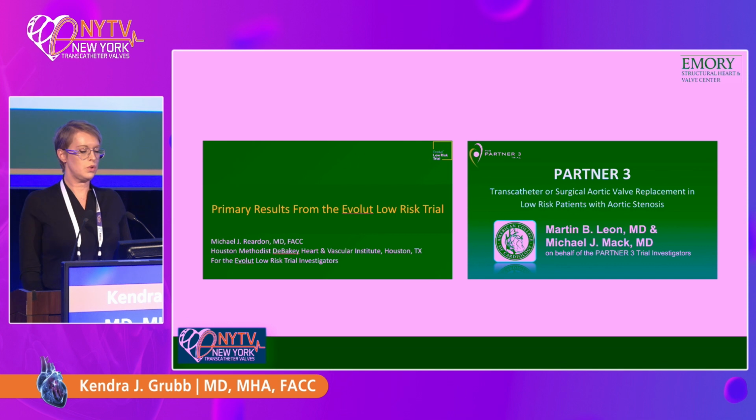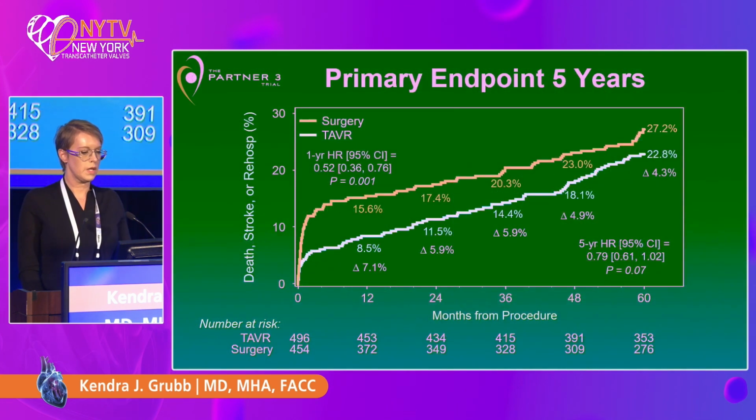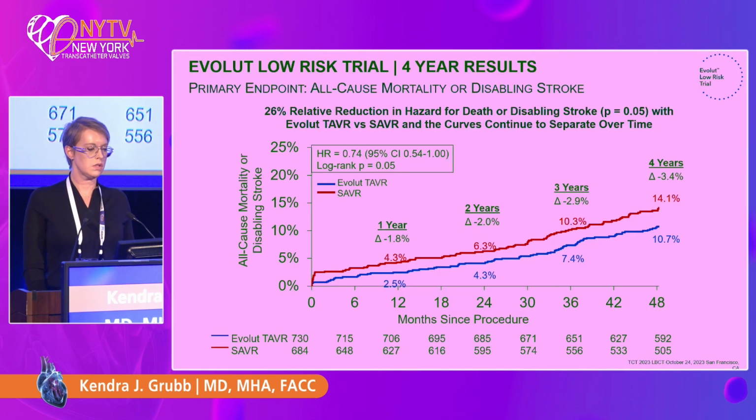As we look to the two low-risk trials, this gives us some midterm, but not long-term, data. And my patient, who's 65, may have many valves in his lifetime. I would certainly presume at least 2. Primary endpoints at 5 years: death, stroke, or rehospitalization. For an intra-annular valve, no difference. No difference also for a self-expanding valve, but this is only out to 4 years.